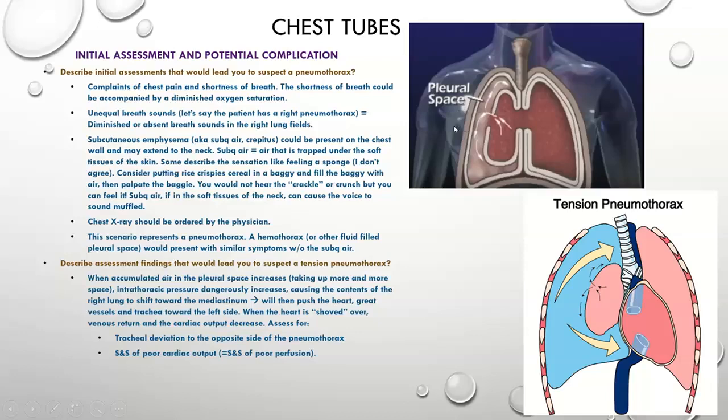I've seen this lots and lots of times. I don't understand the physics to it. I don't even know the physics to it because I don't care. If you're an inquiring mind, that's something you'll just have to look up. But be aware that if you identify subcutaneous air, you better think pneumothorax.